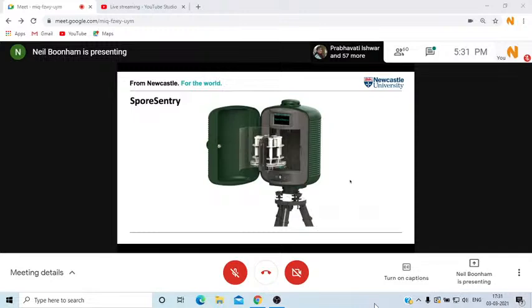This is ongoing work. So this is a CAD diagram of the commercial device here. This has been developed by OptiSense Limited in the UK. You can see the cyclone tubes here, very much simplified. The DNA is extracted here and is transferred into the reaction tubes here. And underneath here, we have a Genie system that is doing LAMP for us.